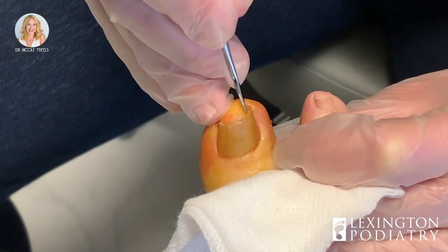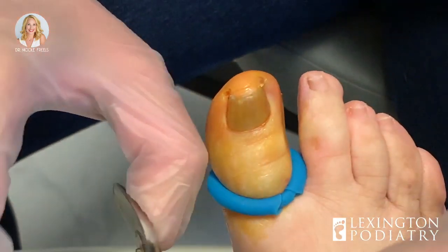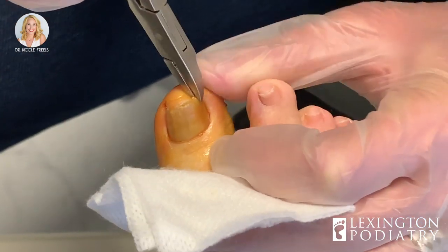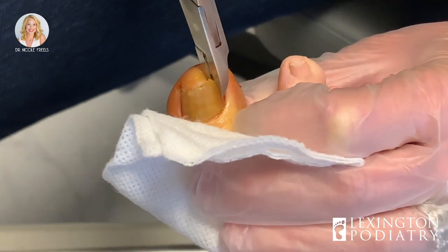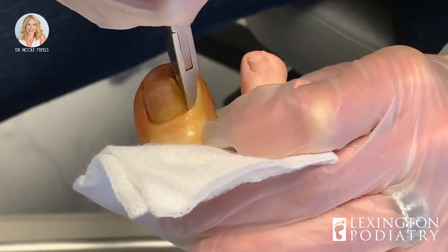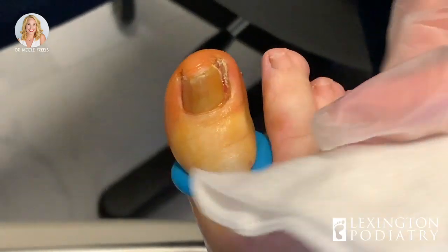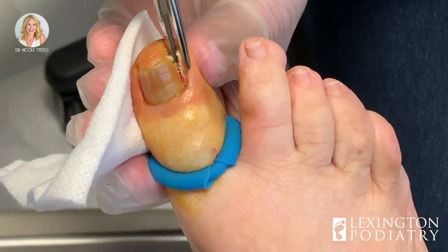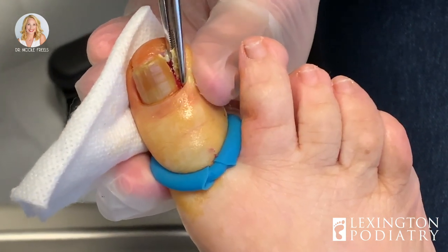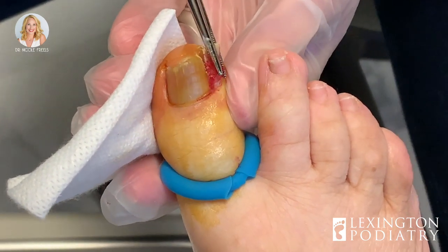Most people are hoping it goes away — they'll put some Neosporin on it and try to avoid coming in. I don't soak it, I just clip that little edge. I can feel how thick this nail is; it goes straight back. We want to get to the root. A lot of people only go to the tip of the nail and relieve the immediate pressure, but the problem is it's going to grow back in a month.